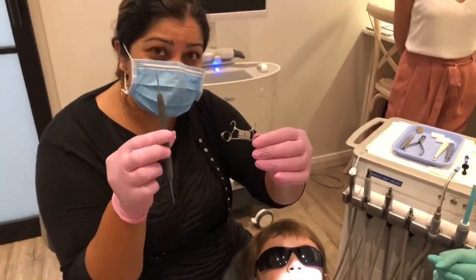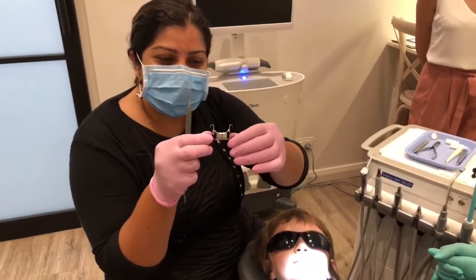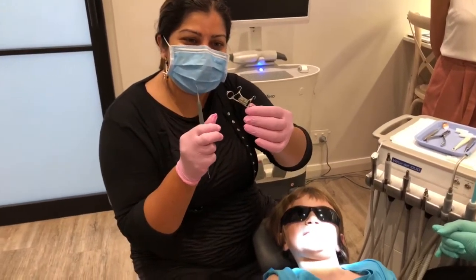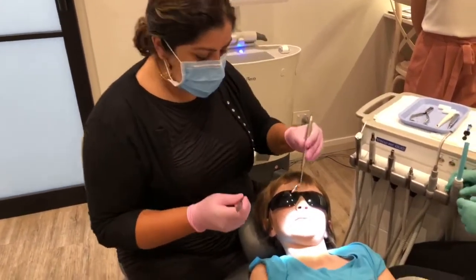I've got a scaler. We'll be removing the spacers that have been put in here for this young eight year old. And that's the expander. So I'm going to start first by removing the separators.